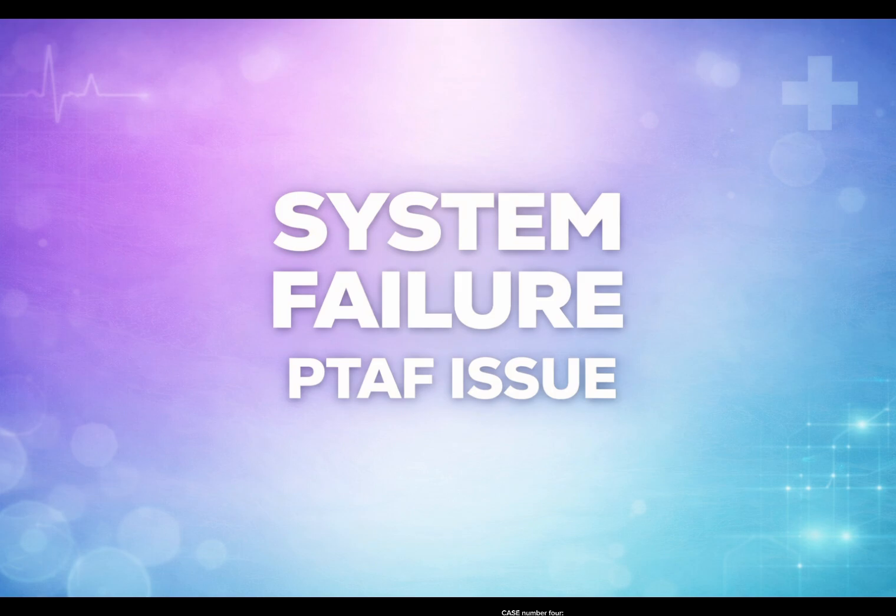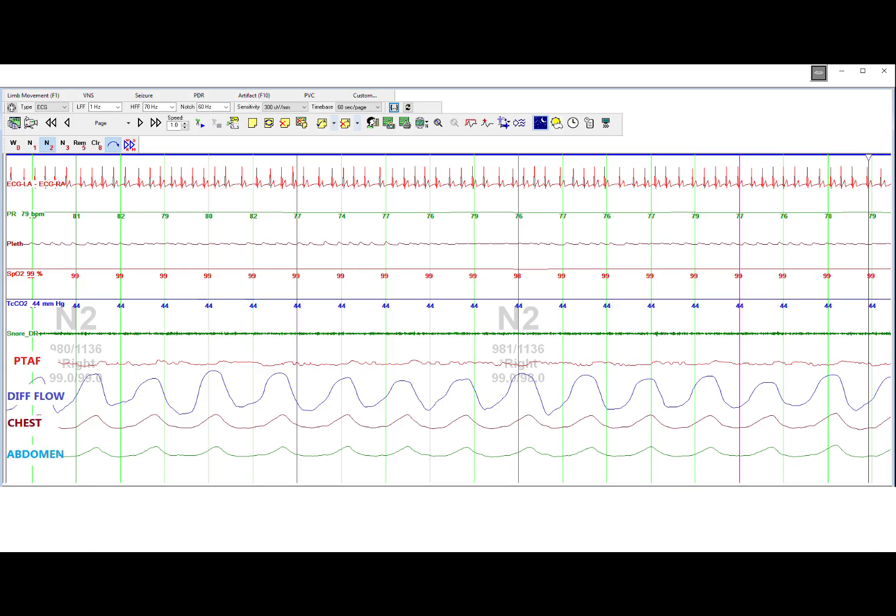Case number 4, flat PTAF, good differential flow. Here, the PTAF signal is flat, while differential flow remains present. This pattern may indicate a sampling line issue, such as occlusion or moisture buildup, rather than a true airflow problem. This is a high-yield distinction. While differential flow remains present, the PTAF signal is flat. This pattern can sometimes be mistaken for apnea.